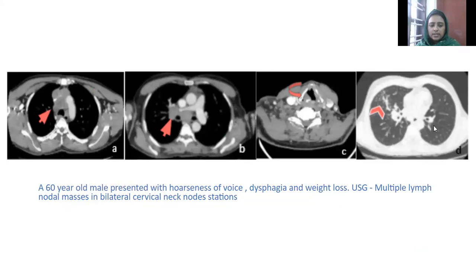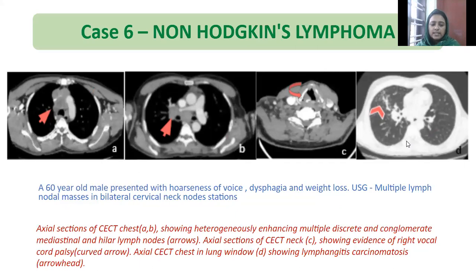Sixth case: a 60-year-old male who presented with hoarseness of voice, dysphagia, and weight loss. Ultrasound showed multiple lymphoid masses in bilateral cervical lymph node stations. Axial sections of CT chest showing heterogeneously enhancing multiple discrete and conglomerate mediastinal and hilar lymph nodes. Axial CT neck images showing evidence of right vocal cord palsy, and in lung window showing lymphangitis carcinomatosa. Biopsy revealed Hodgkin's lymphoma.